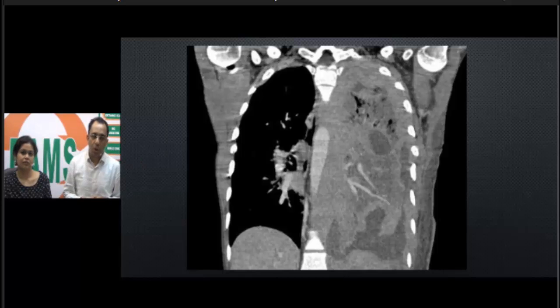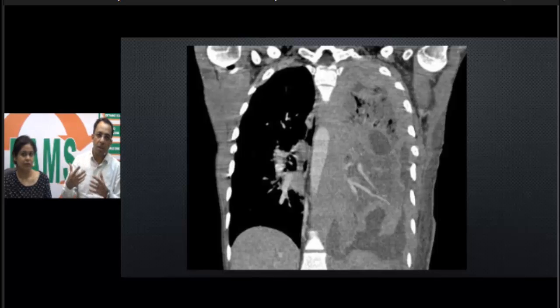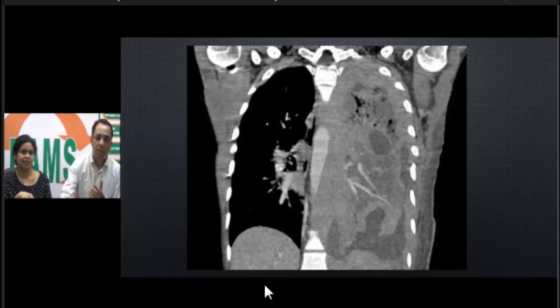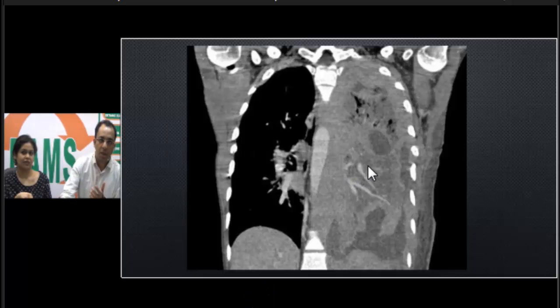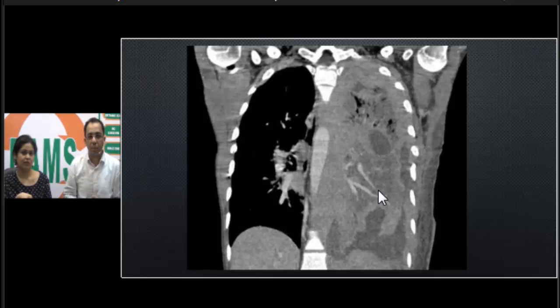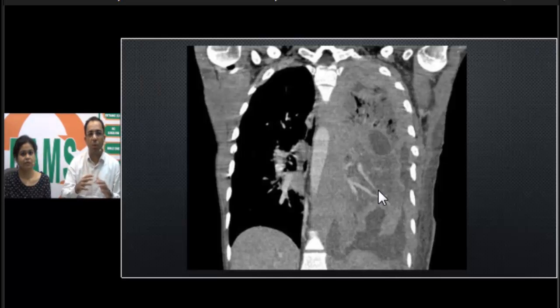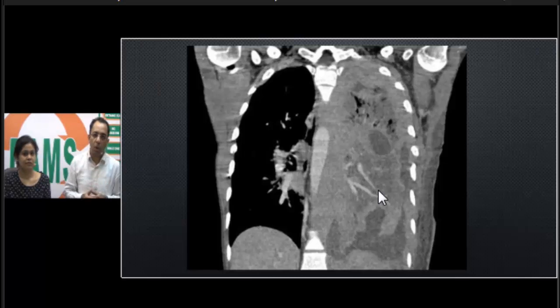Another radiological finding — which Diksha can add pathological correlation to — is that these lesions have a mucinous content, giving them very low attenuation on CT. When contrast is administered, the vessels stand out against the low-density background. This has been called the CT angiogram sign. Initially it was thought to be very typical of bronchoalveolar cancer; it is now considered slightly nonspecific, but still a classic finding to know.